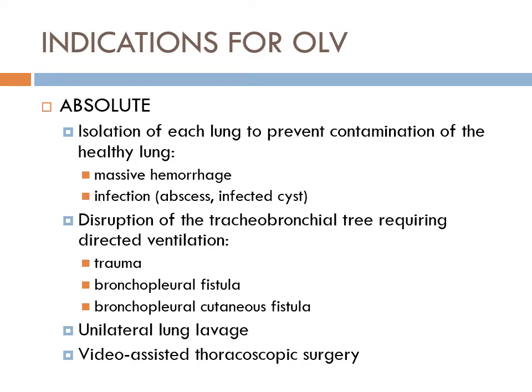How do we isolate a lung? I mean, what do you think the most obvious answer would be? How do we isolate the trachea from gastric contents being aspirated into the trachea? You throw in the tube and blow up the cuff, right?